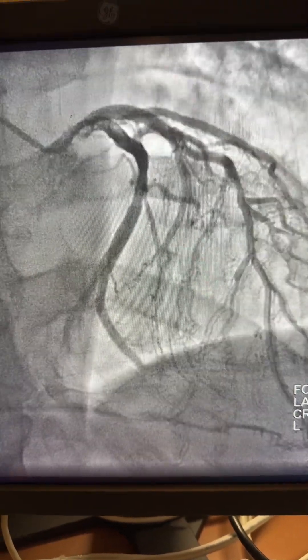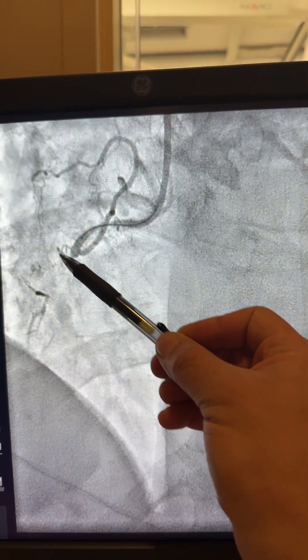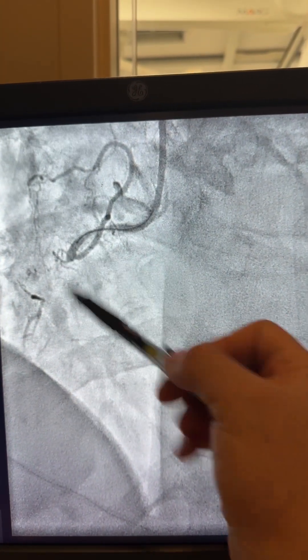I attempted first with a run-through wire, but the run-through kept going toward that side branch. I kept the run-through in that branch.